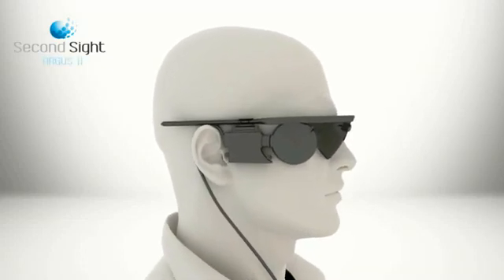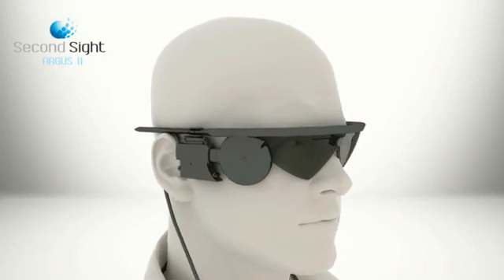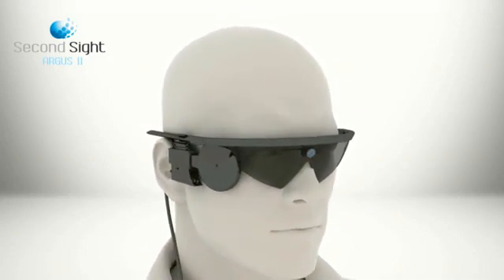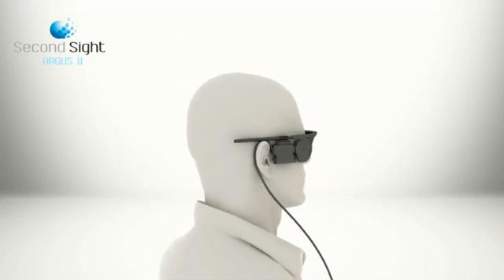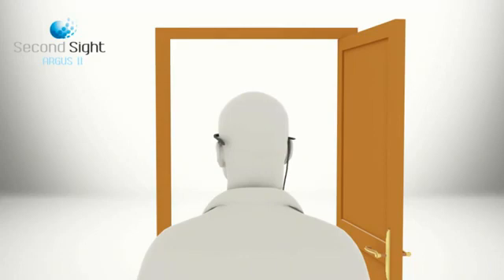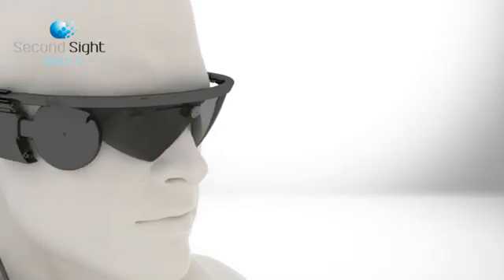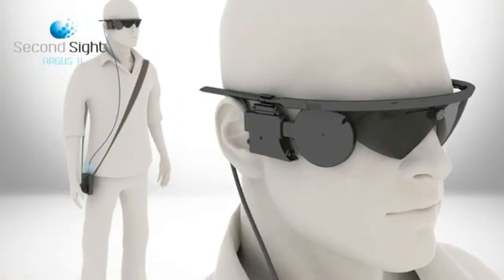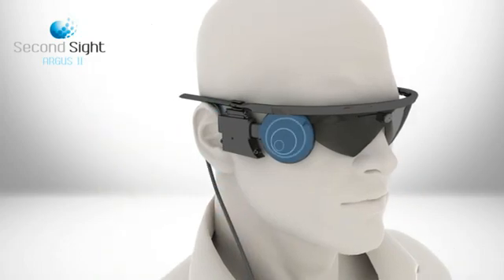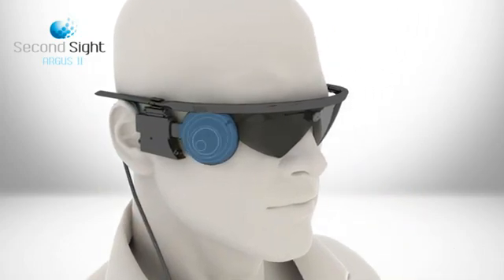In SecondSight's Argus II retinal prosthesis system, a miniature video camera in the eyeglasses captures a scene. The video is processed by a small portable unit and transformed into instructions, which are sent back to the glasses. These instructions are then transmitted wirelessly to the implant on the eye.